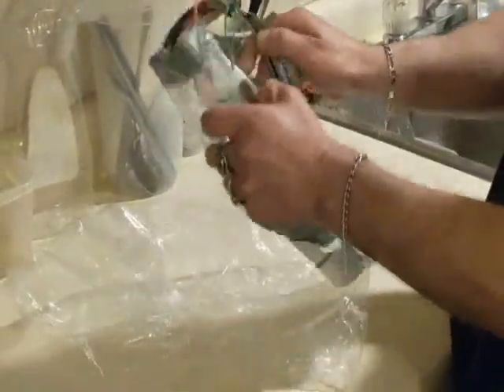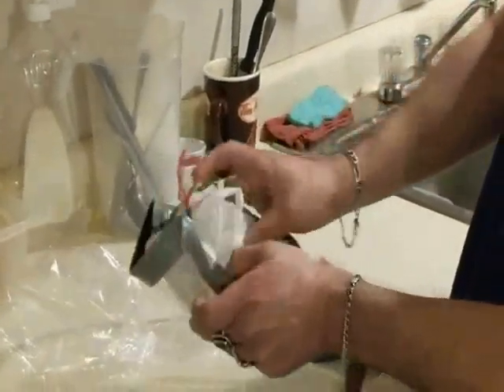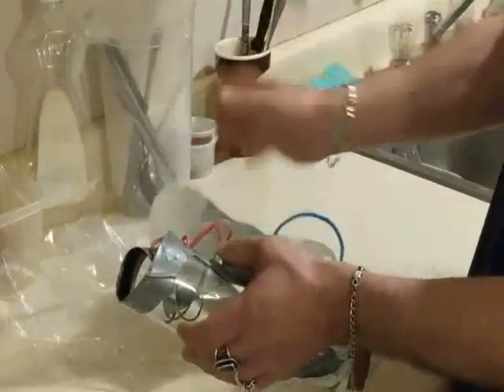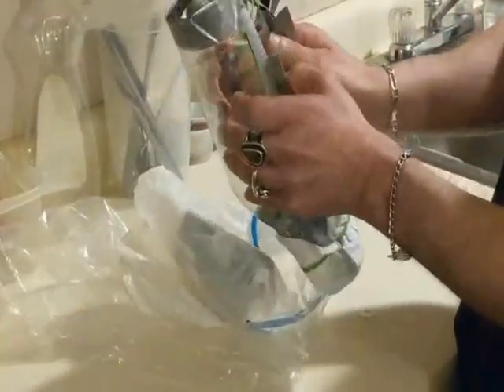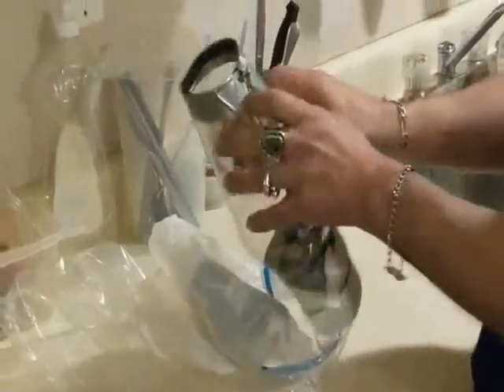So it's in a plastic bag. I have it there. There's a special thing I will talk to you about, that plastic unit that I'm pulling out right there. I will get back to that with the elastic band. I'll get back to it. But I'm showing you the filtration mask right now.